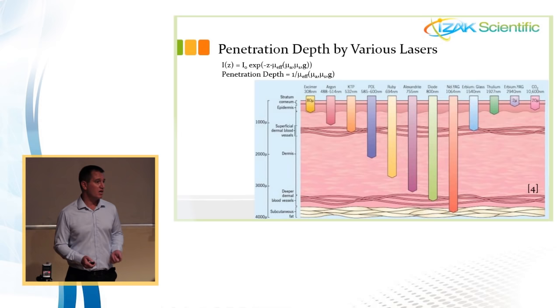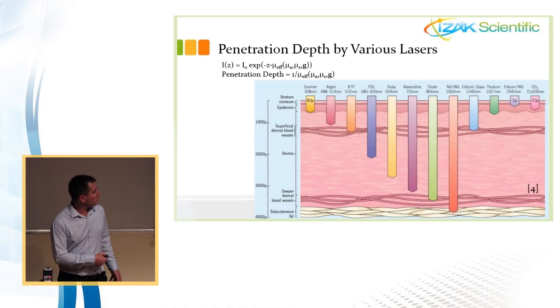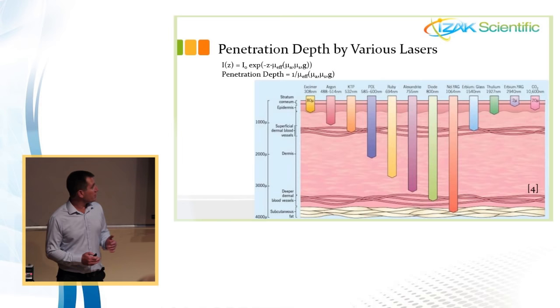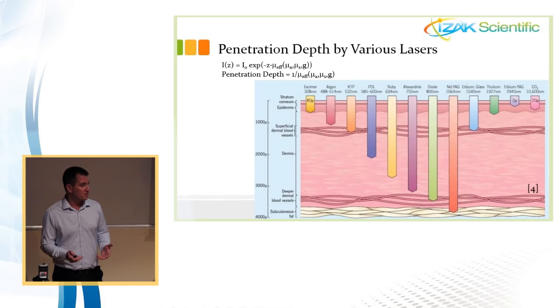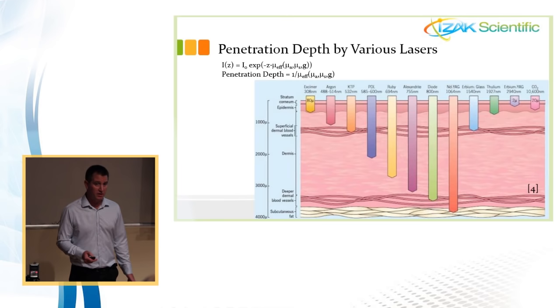So we use it for different applications, for example for interaction with hard tissue, for teeth or for bones, to cut or to incise. Near it, there is the CO2 laser with a penetration depth of about 20 microns. The penetration depth is also superficial, and it can also tie off very narrow blood vessels, which is good during surgery. But since the absorption is very high and the penetration depth is relatively low, we cannot work with applications where the waveguide is immersed in water, for example inside the bladder or the urethra, or in a place where there is irrigation during the surgery. There are other lasers with a relatively long penetration depth that can be used for coagulation or for hemostasis.